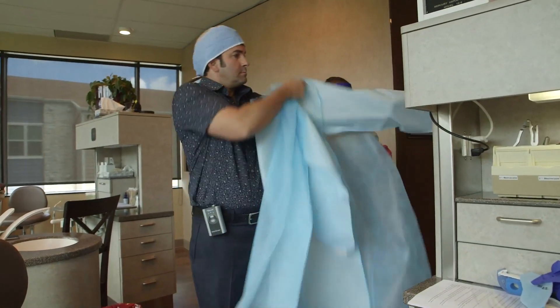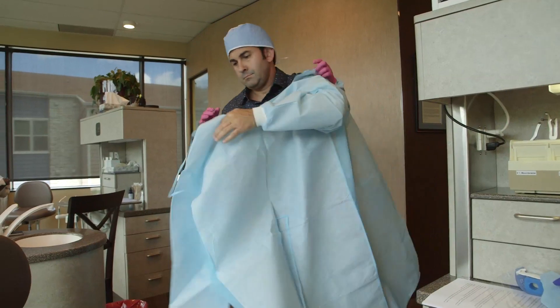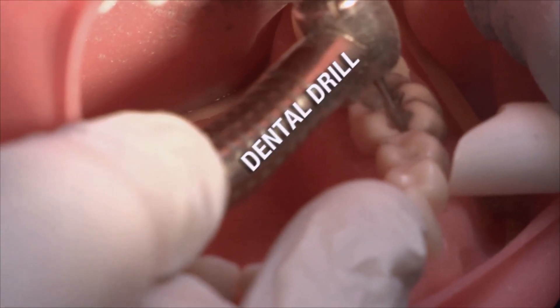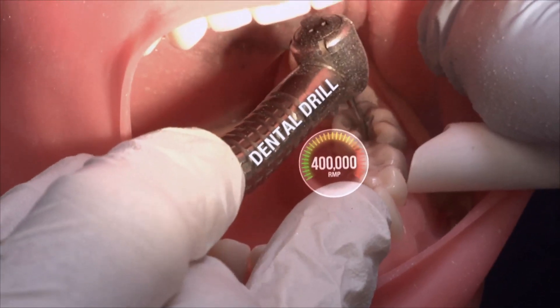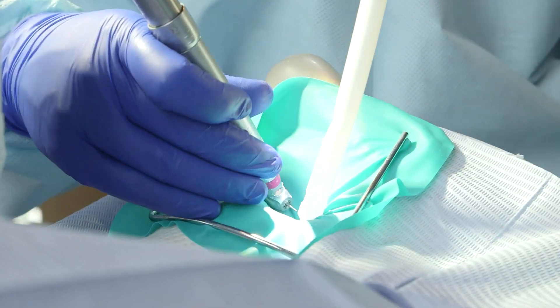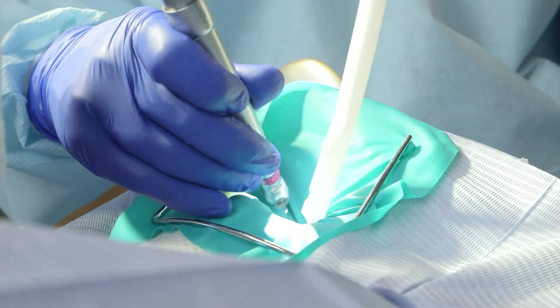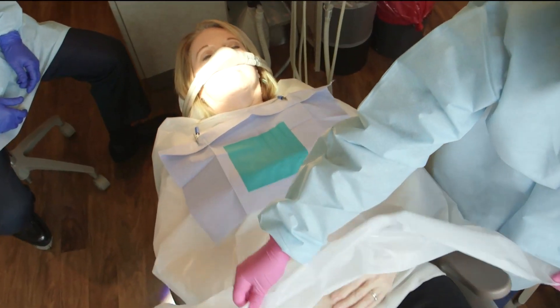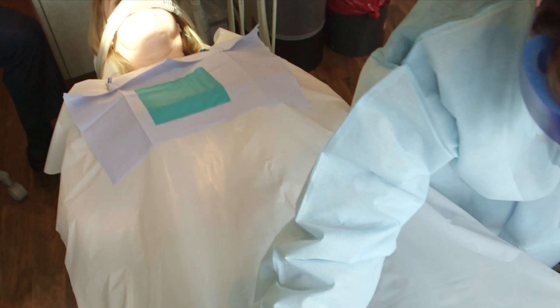Protective gowns and covers for the dentist, dental personnel, and the patient should be in place. All present in the room should be protected because substantial quantities of particles generated during the procedure will elude collection by suction devices. It has been demonstrated that these particles can be spread from the patient's mouth to the patient's knee and to the chest, shoulder, and neck of the dentist and dental assistant.